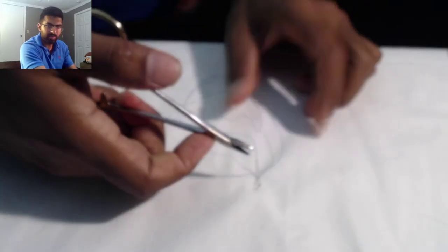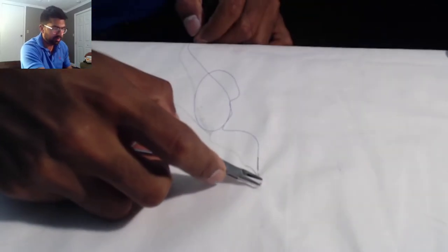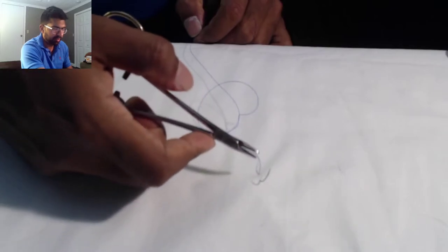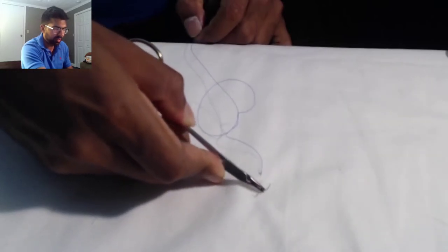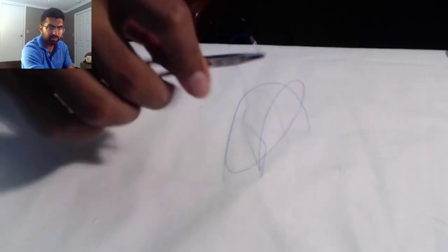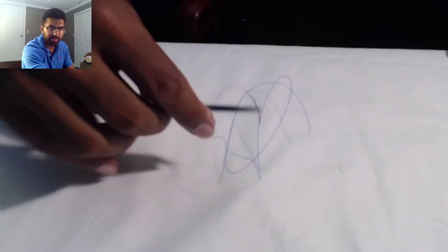Now, unclick, same thing. I'm going to go into pronation, grab the needle from the front, pronate a little bit, get it back to where I want it, click, and then pronate out. Now, here, if you pronate out, you can spin the needle back, get it ready for the next bite.